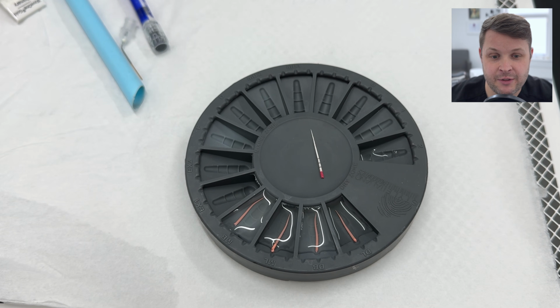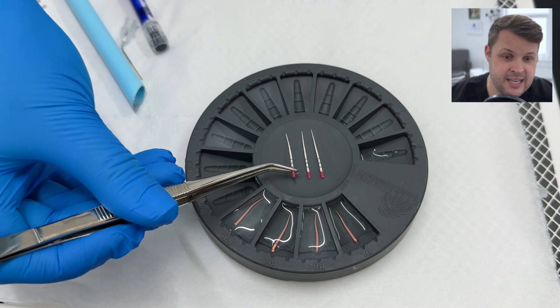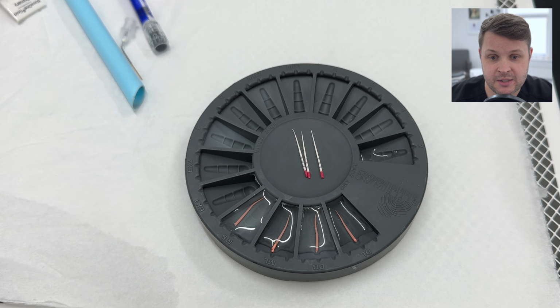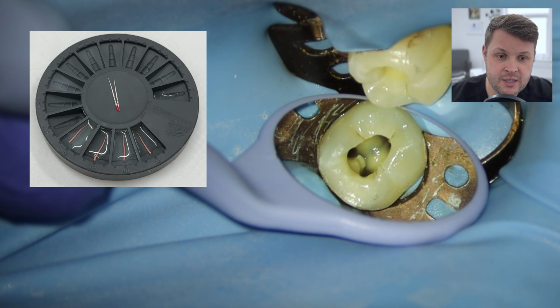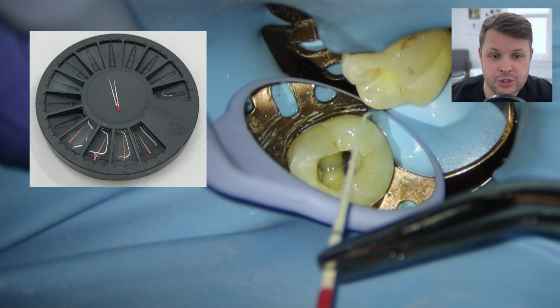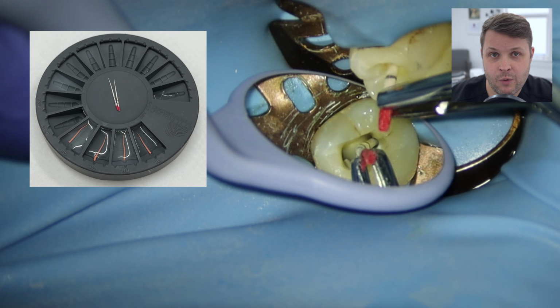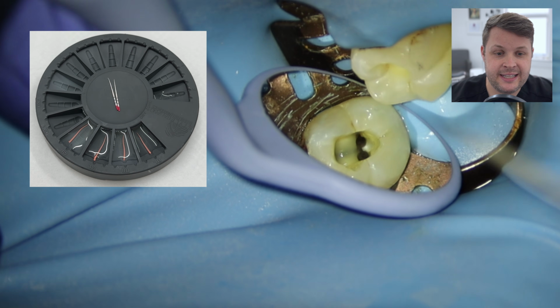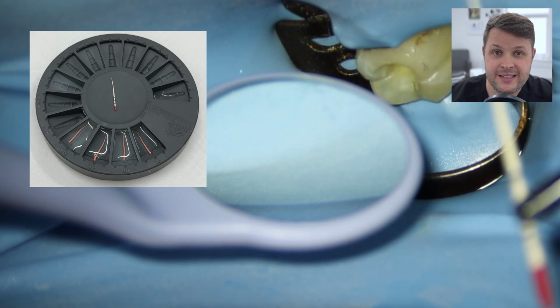And you can see here now the nurse is setting up the paper points, and basically I'm just going to take the paper point from that area, from this little disinfector, and place it to length. And once I place the paper point to length, I'm just going to pull it out and inspect the end just to see how wet it is. And I'm just going to continue this drying of the canal spaces until it's completely dry.